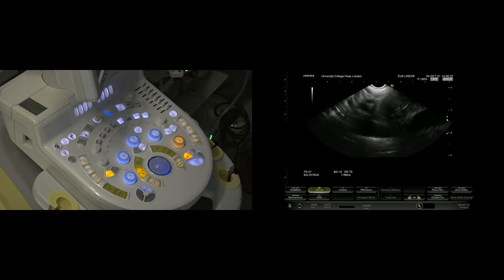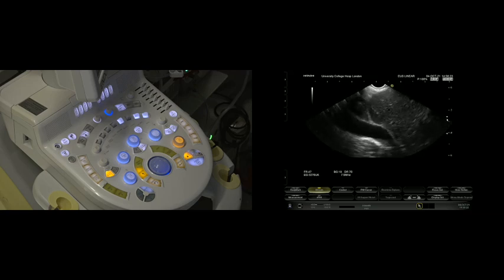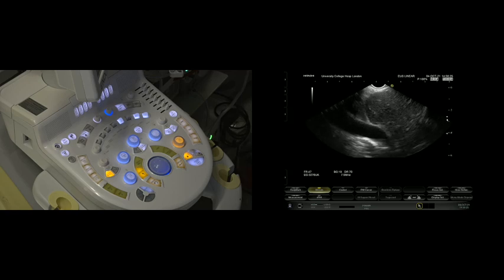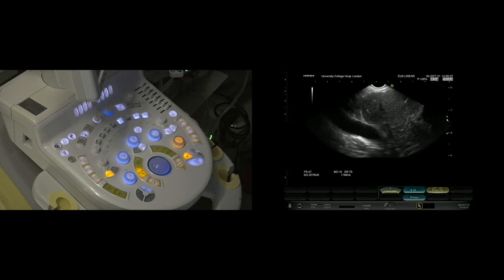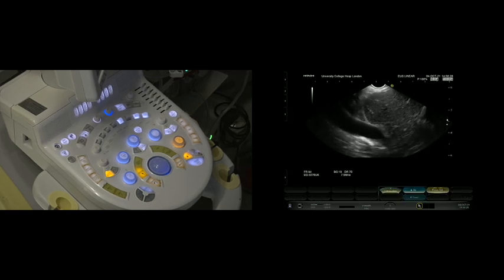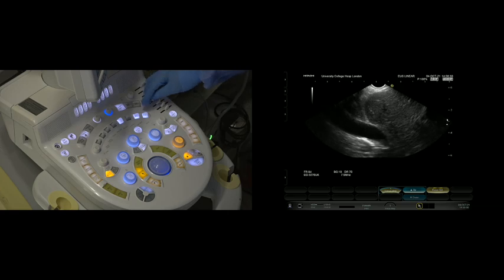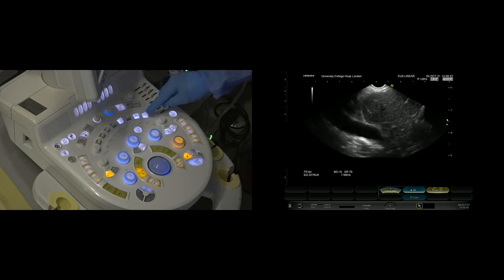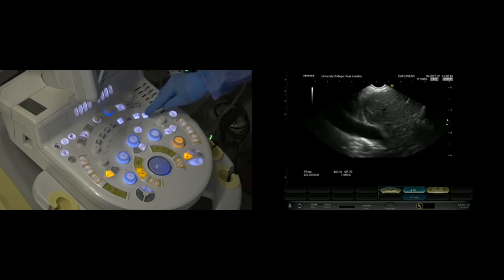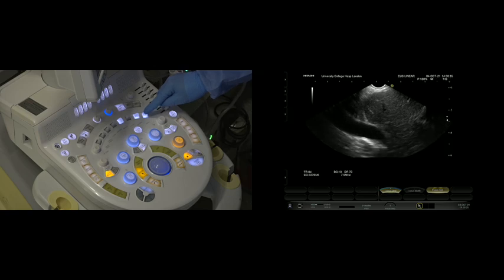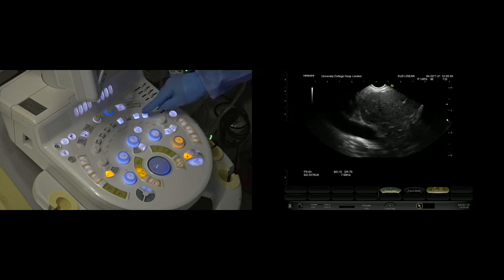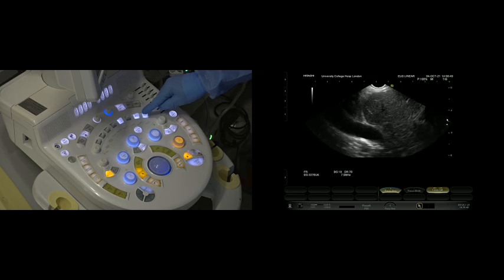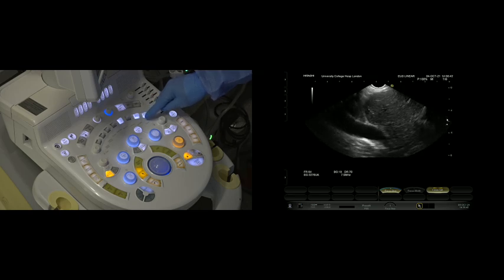I've always quite liked to have one focal point, so I'll reduce that to one. Then one of your buttons on your system, or here on this particular console, focuses top right, and you can see how we are enhancing, focusing in on the bit we need. That's the first thing.